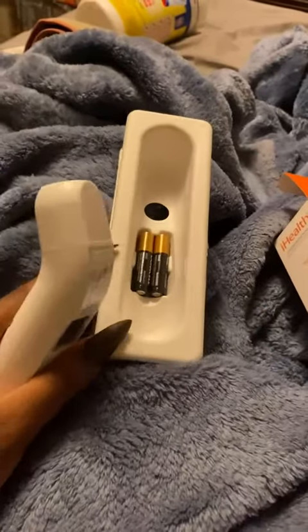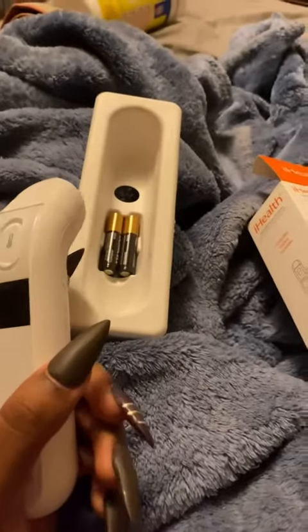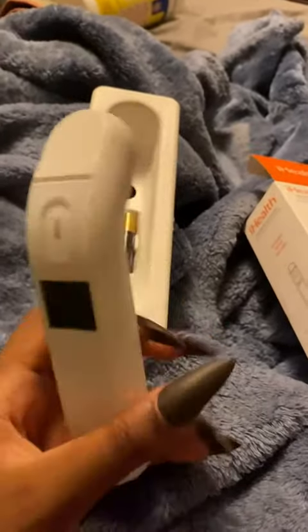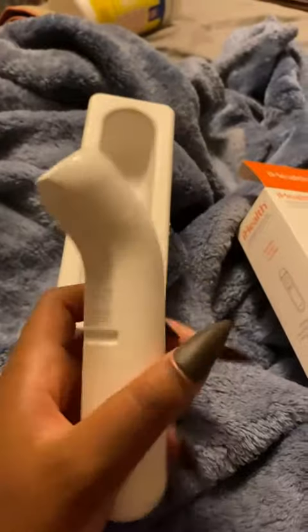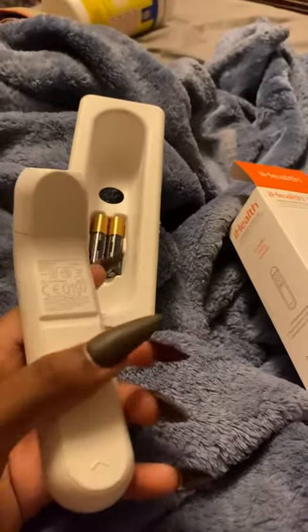I can't demonstrate it right now because the batteries are not in it, but this is where you put the batteries. You slide this up and it reveals where the batteries go, then you put the batteries in.